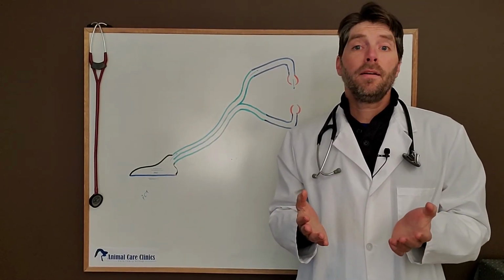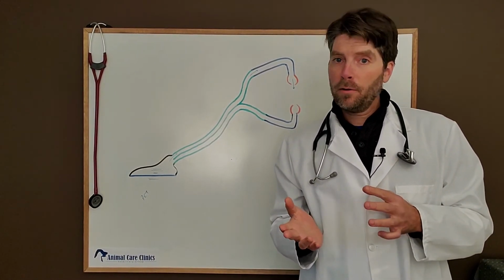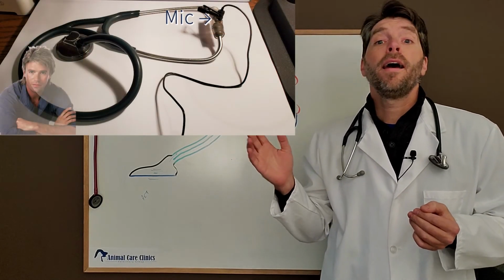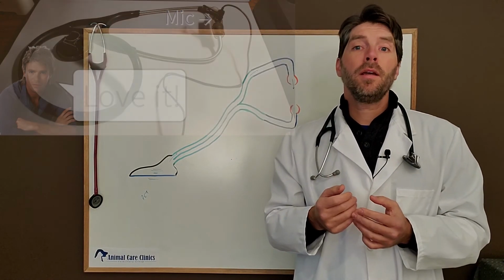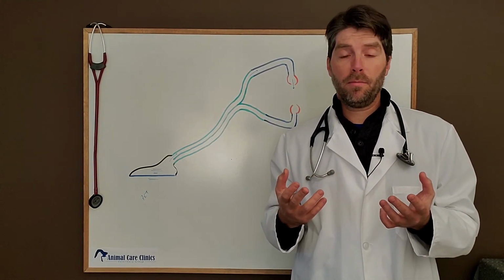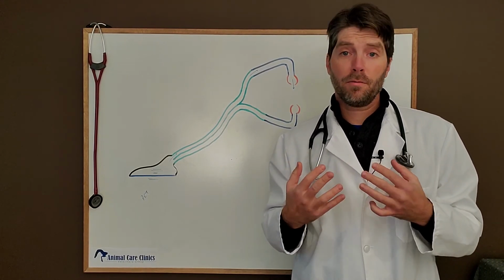So finally, I've got some recordings for you. I am a little proud of myself. I MacGyvered a stethoscope so you could listen to this. And what I've got for you is a nice, normal sounding heartbeat from one of my cats. Hear the nice rate and rhythm.